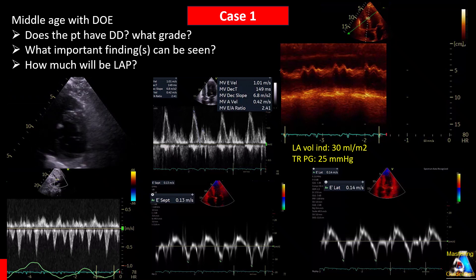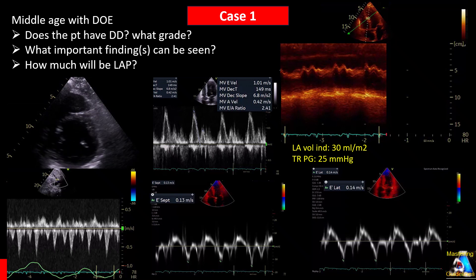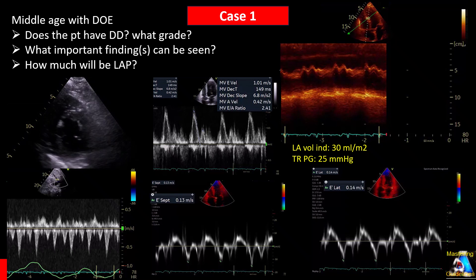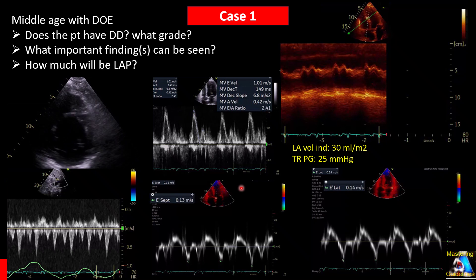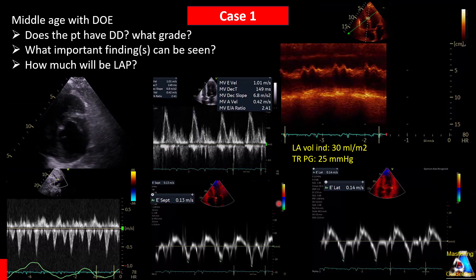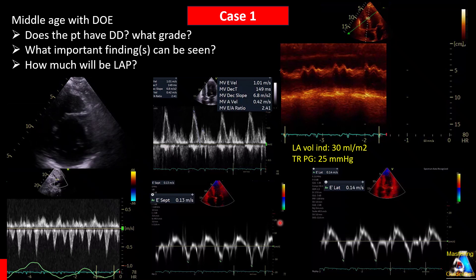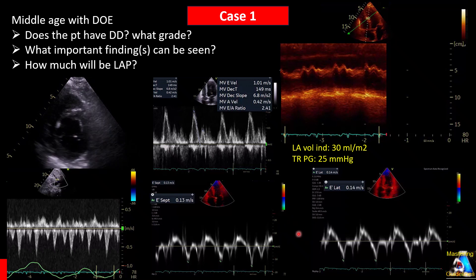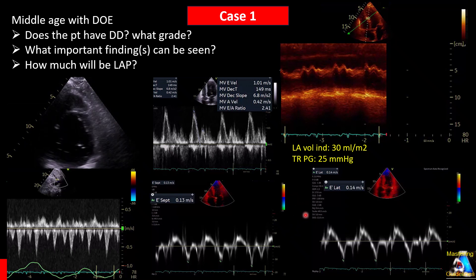Now let's go to case one. Here we have a middle-aged patient with exertional dyspnea. Look at the findings on Doppler, 2D, and M-mode. First of all, does the patient have any type of diastolic dysfunction or not? If the patient has diastolic dysfunction, what type and grade? Also, there are two important findings on this case — can you find and mention at least two?